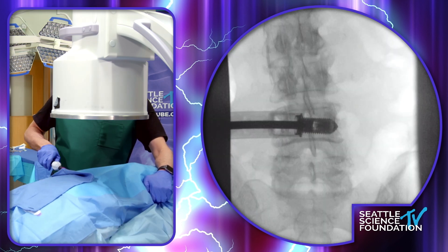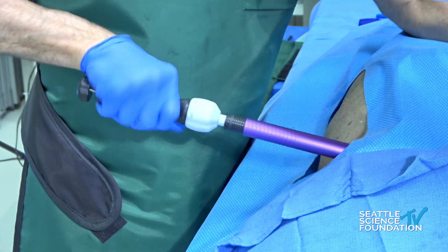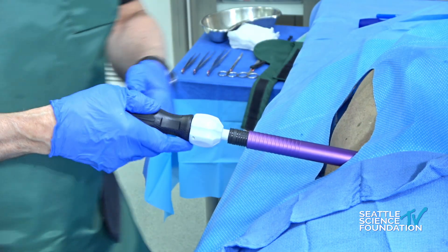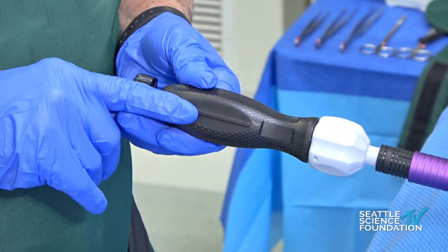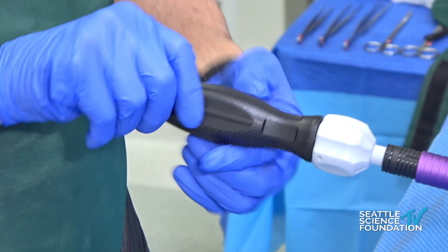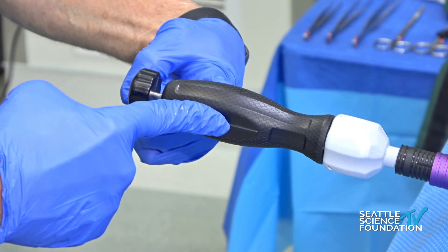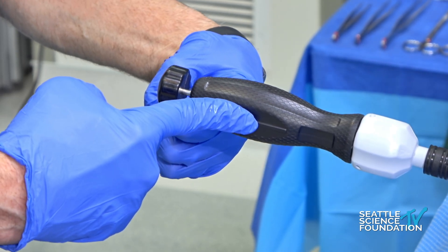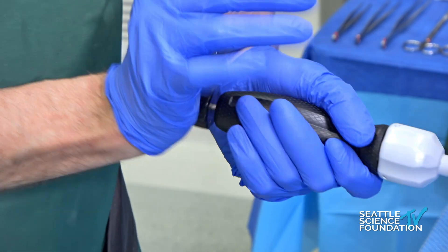At this point, I'm going to look for the wings that come off of the implant. There's a wing reference line right here. This line needs to line up — that means the wings are going to come up off of this point. So, we put the wing reference lines superior and inferior, and then we deploy. We'll deploy it by doing this — hitting on the distal end of it will deploy the wings.